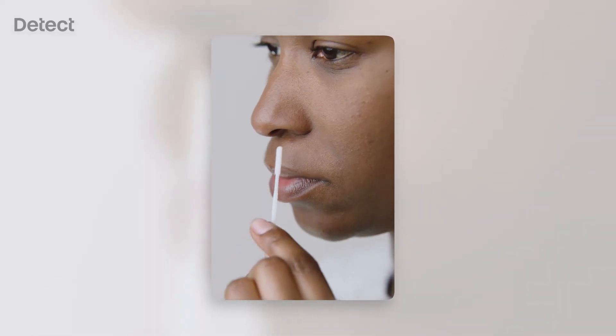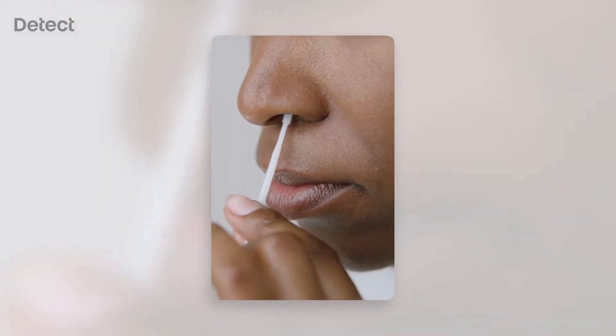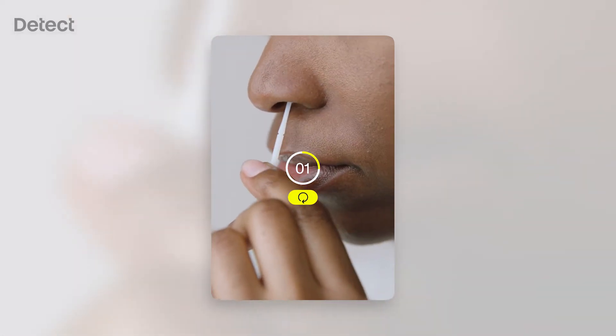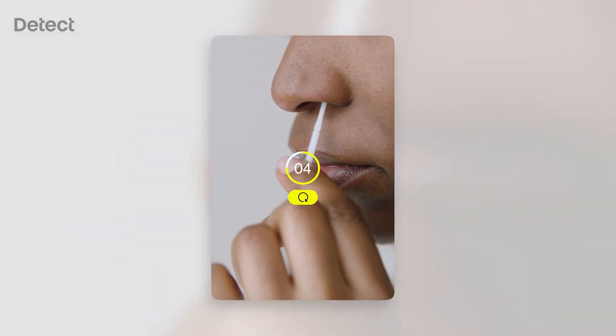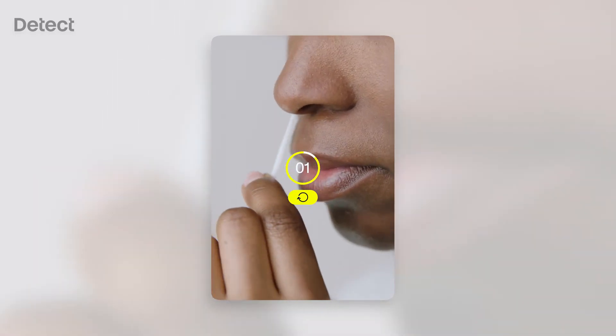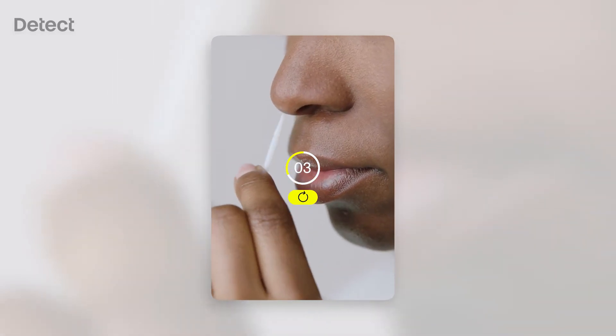Insert the swab in one nostril, just until the soft tip is completely inside. Swab the inside wall of the nostril in a circle five times, keeping the swab tip in contact with the nostril wall. Repeat with the other nostril.